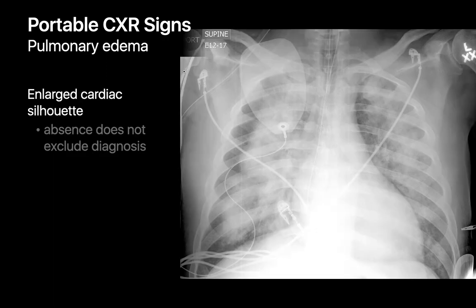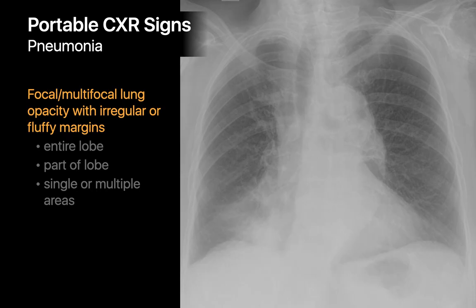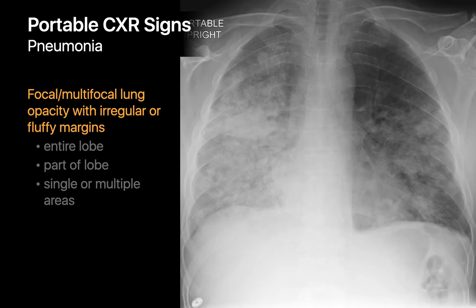New lung infection pneumonias on inpatient portable chest x-rays may present as new focal or multifocal fluffy lung opacities. Our specificity for correctly calling lung infection pneumonia tends to be better in the upper lungs than in the lower lungs, since subsegmental atelectasis and aspiration pneumonitis can also present as focal opacities and are leading competing differential diagnoses in the lower lungs.